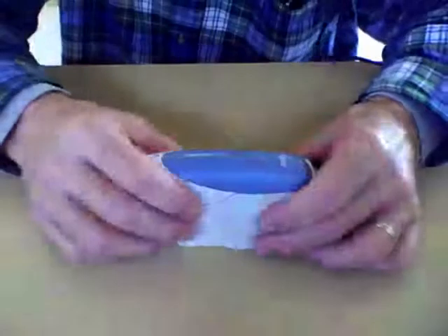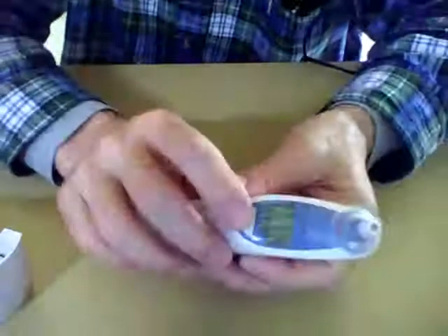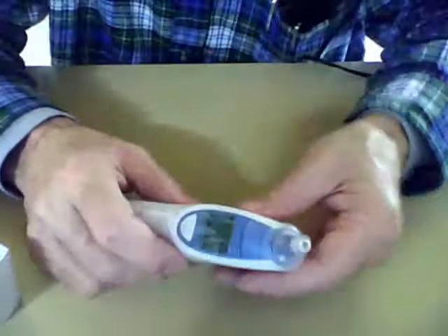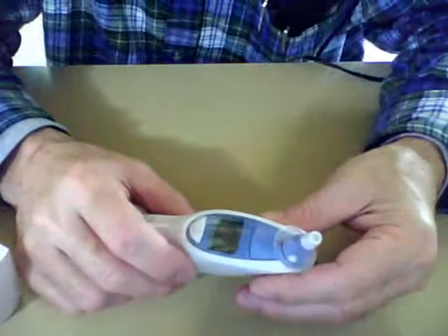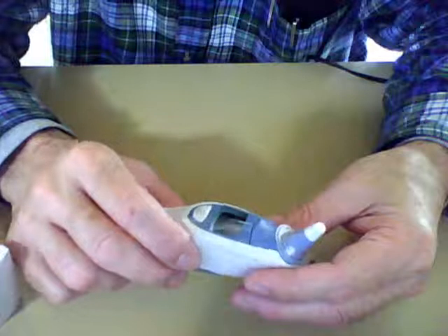And this is a little thermometer. Basically buy these at Walmart. Just turn it on, stick it in your ear, and it's great for someone that's the caregiver to get the temperature of somebody that's in paralysis. It's really non-invasive and real easy to use. And if their temperature's up, it can help you make determinations about what to do for them.